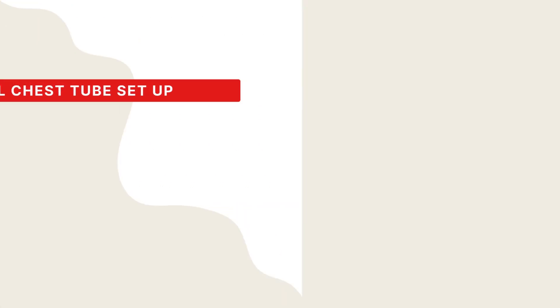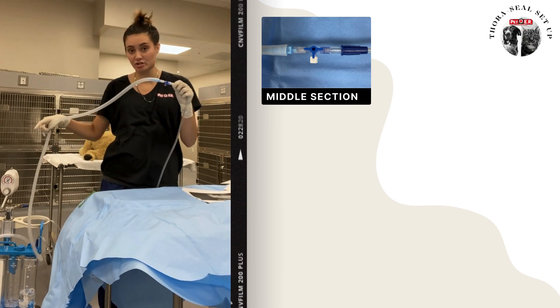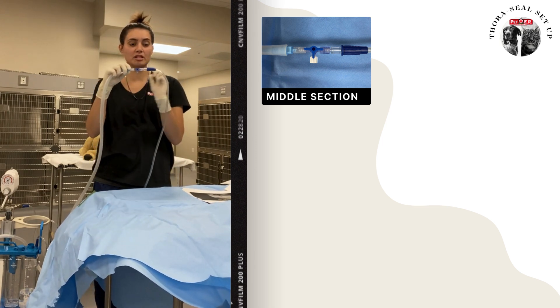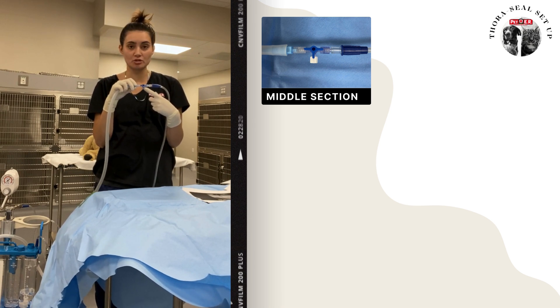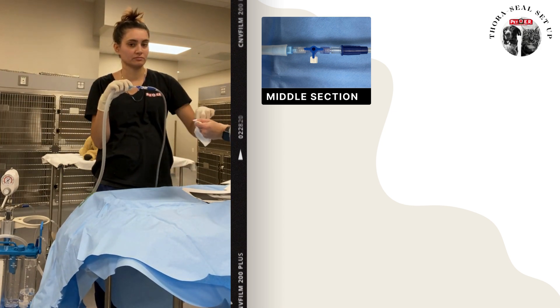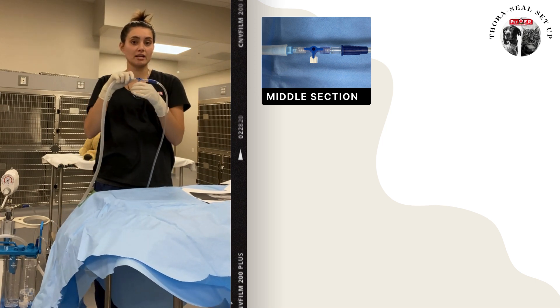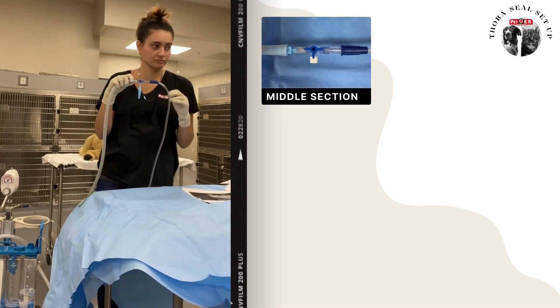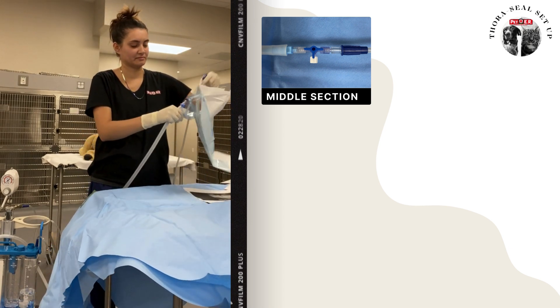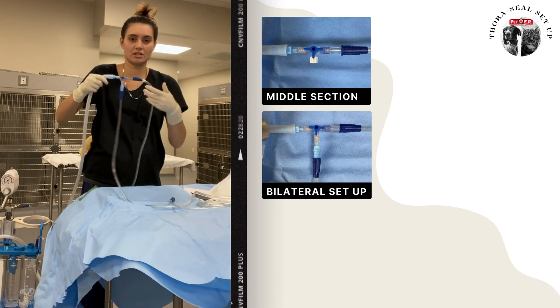If we're doing bilateral chest tubes — two chest tubes — you're going to take your pieces that were originally attached directly to your Thoraseal, the thicker tubing, and make an attachment to go down the middle. Your buddy is going to hand you a male Christmas tree, specifically the blue ones. That is going to attach right at the bottom here. Then they're going to hand you a new suction tubing, and that is going to attach right here.